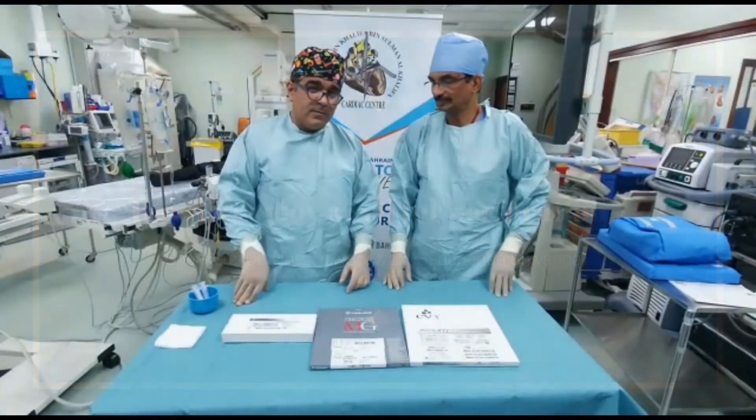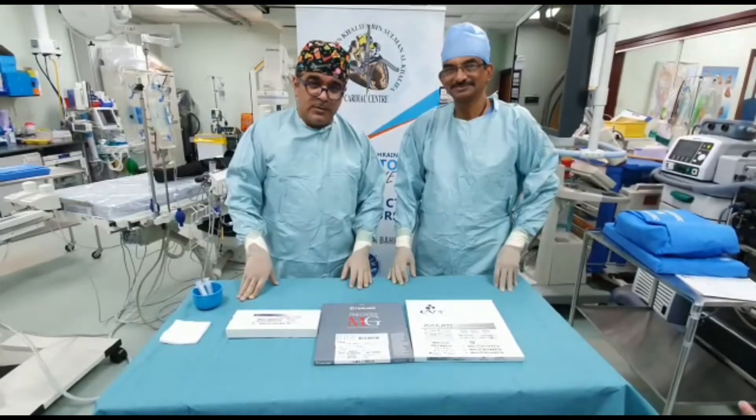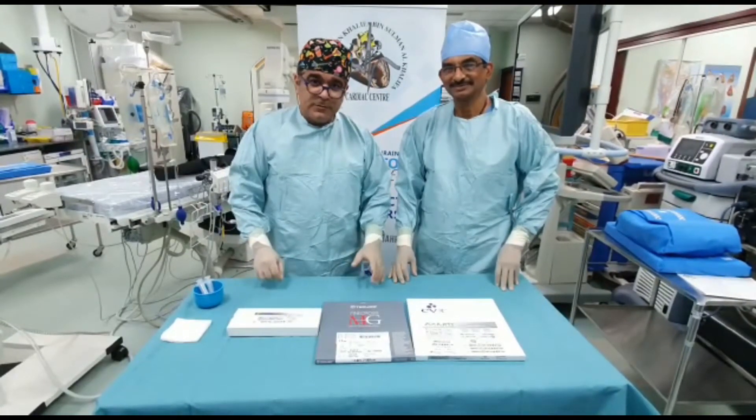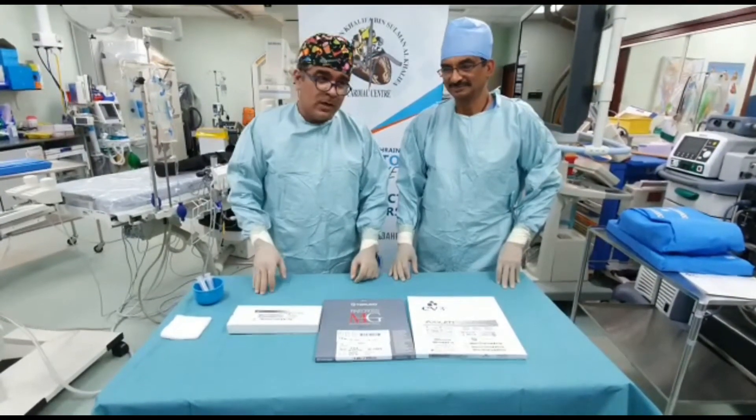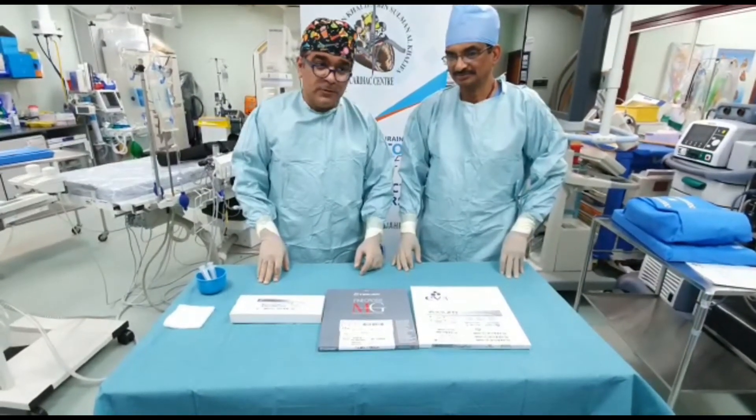I'm Hossam Noor from Mohamed Bin Salman Cardiac Center. I'm joined with my colleague Dr. Sadananda. The purpose of this short video is to show you how you deploy coronary coils in case of perforations.